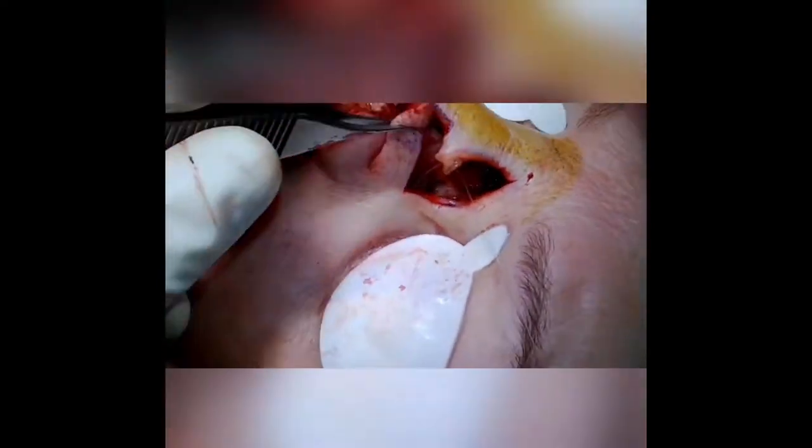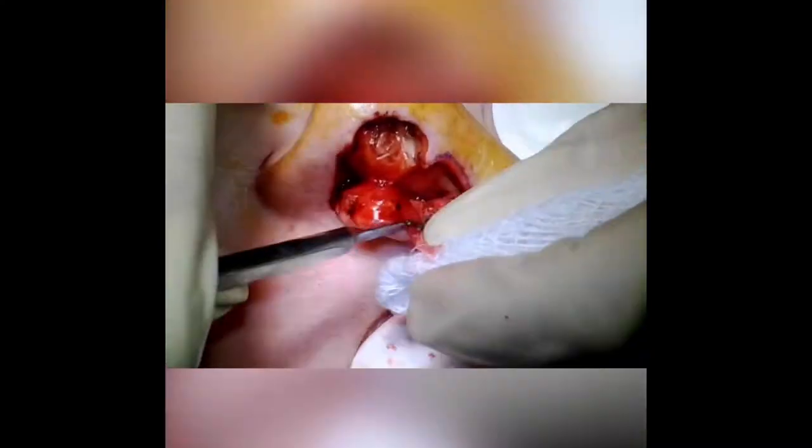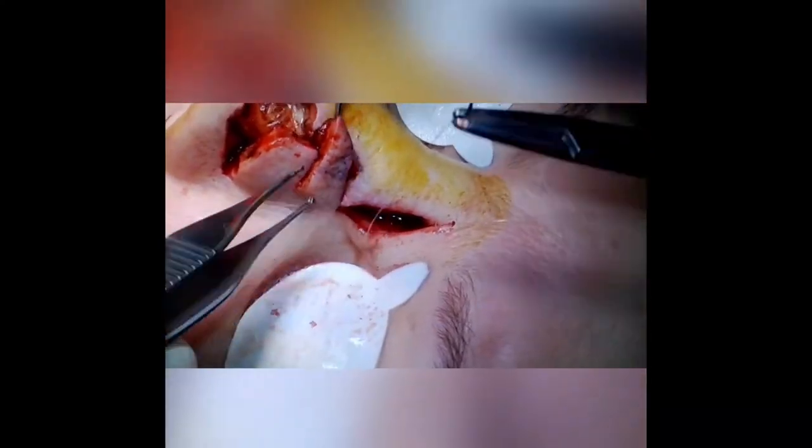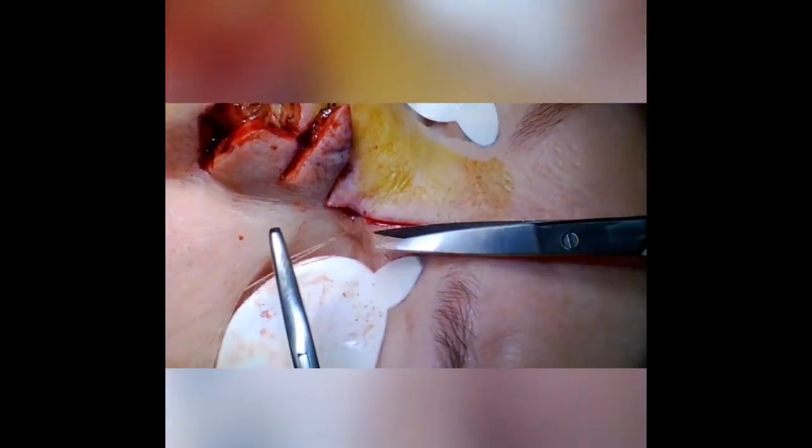This is a 4-0 Monocryl on a PS2 needle. We're closing the donor site for the second lobe first. I usually put a couple of sutures in here to hold everything in place, holding the flap in position while I close the donor site defect from the second lobe.